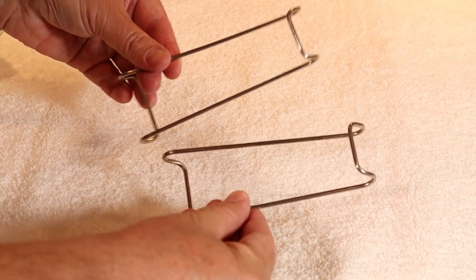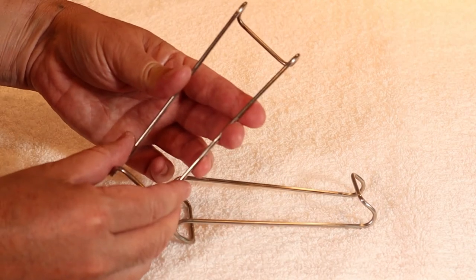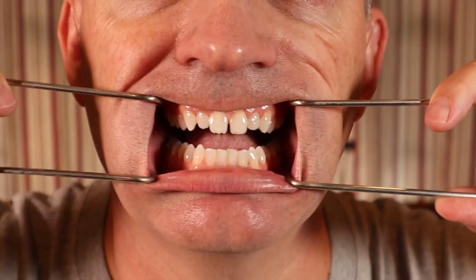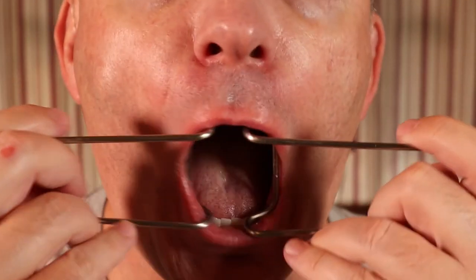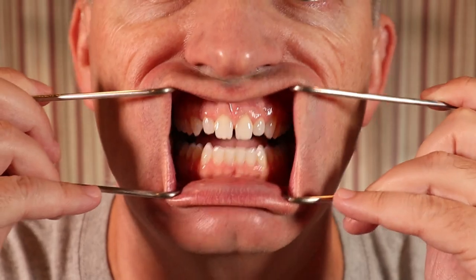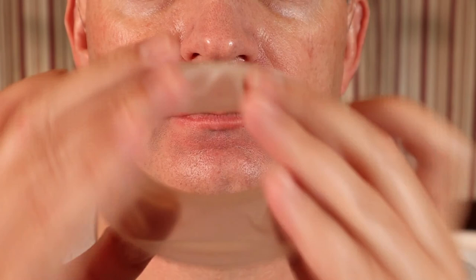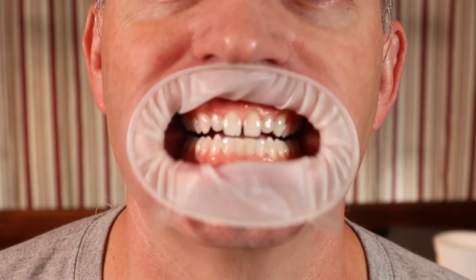Other items I use regularly when I take photos are some retractors. My main retractor is a set of wire retractors — I slip them into the patient's mouth and ask them to hold the ends. There's a large end and a small end. Since they're metal, they're sterilizable after each use. I occasionally use a disposable retractor called the OptraGate. This item comes in two sizes — small and large. I found that it either works really well or it doesn't work at all.